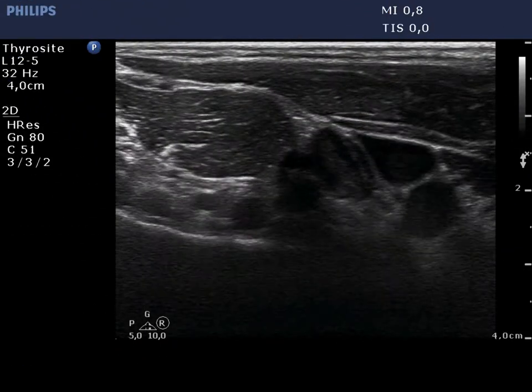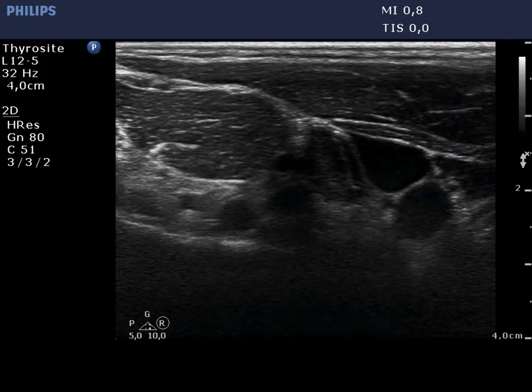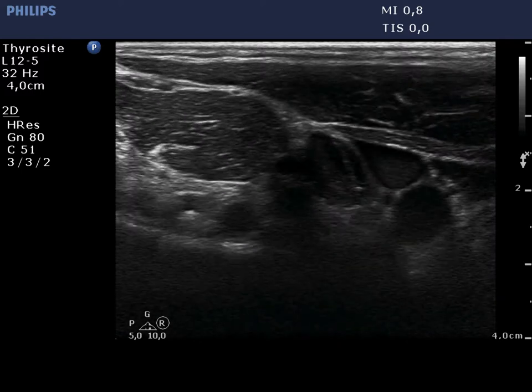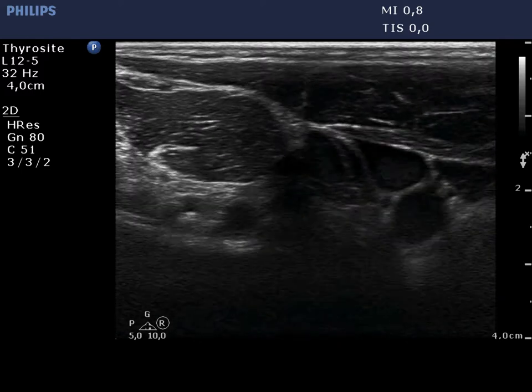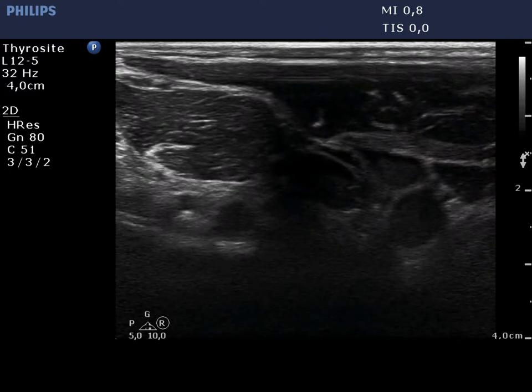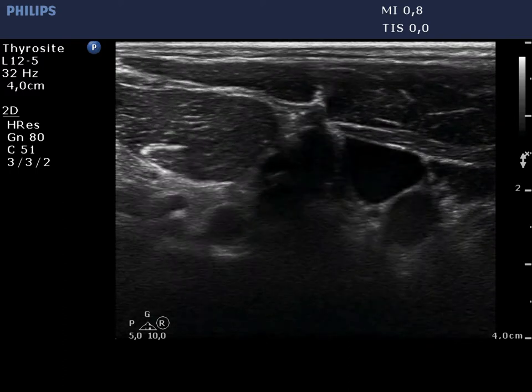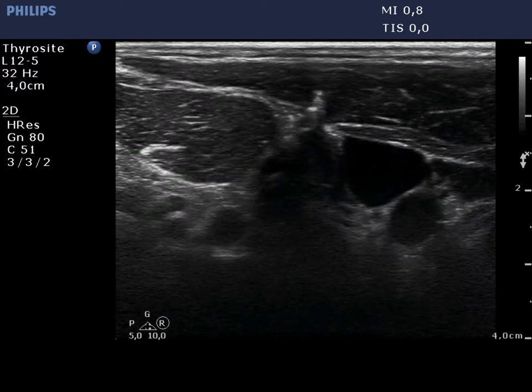Finally, a US-guided aspiration is demonstrated. Initially only the movement is visible, but at the end even the tip of the needle can be seen within the node.